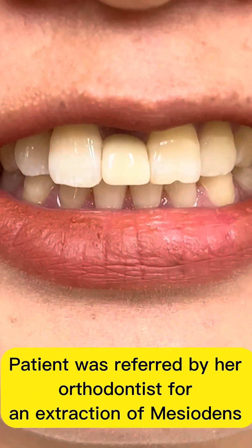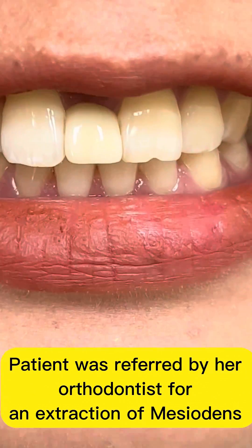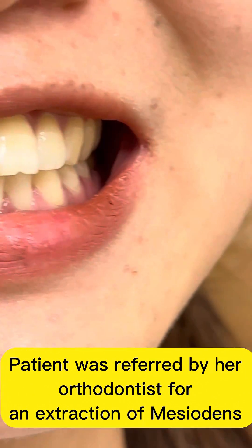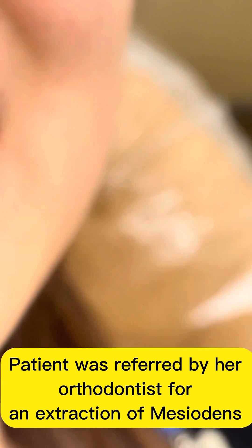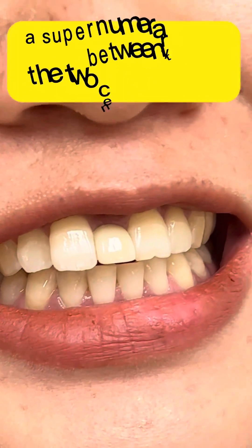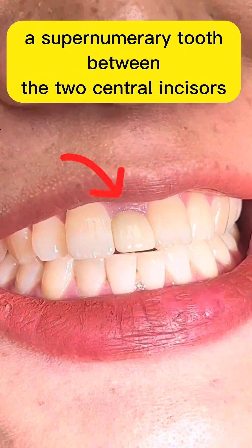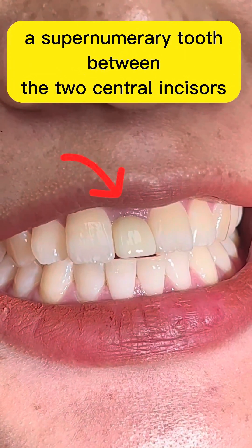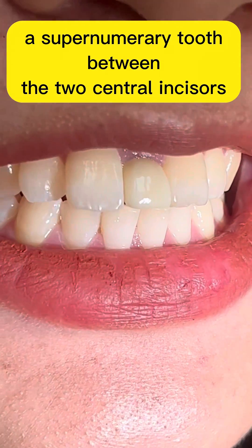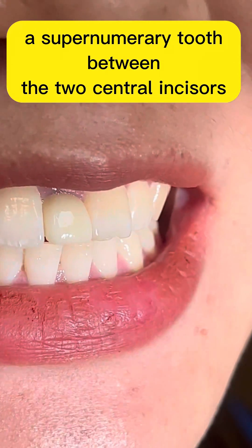Patient was referred by her orthodontist for an extraction. The condition here is mesiodens, which means it is a supernumerary tooth present in the midline, between the two central incisors.